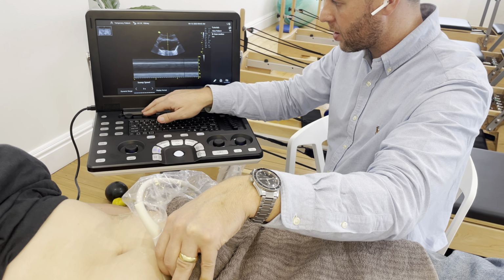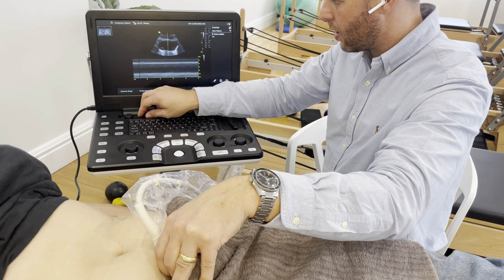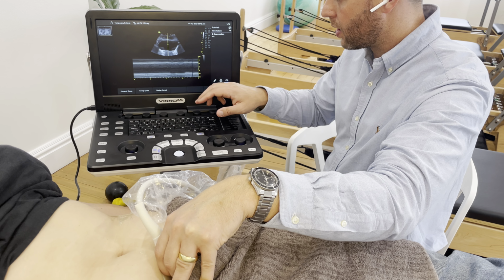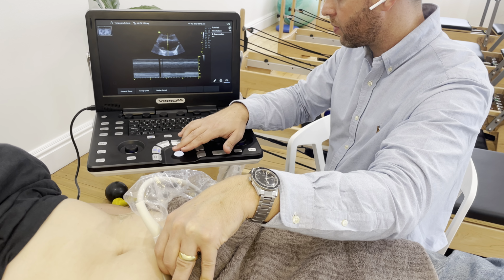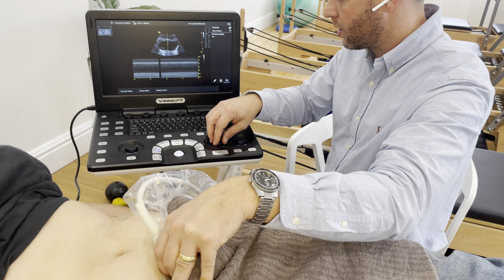Now you can change the sweep speed. I can see it's going across quite fast. I want to make that pretty slow as possible really, so that I can see as much movement as possible there. So that's probably about right. Okay, and then I'm just going to position. You can move the line here just by using the trackball. Okay, and now I'm pretty happy with this image.